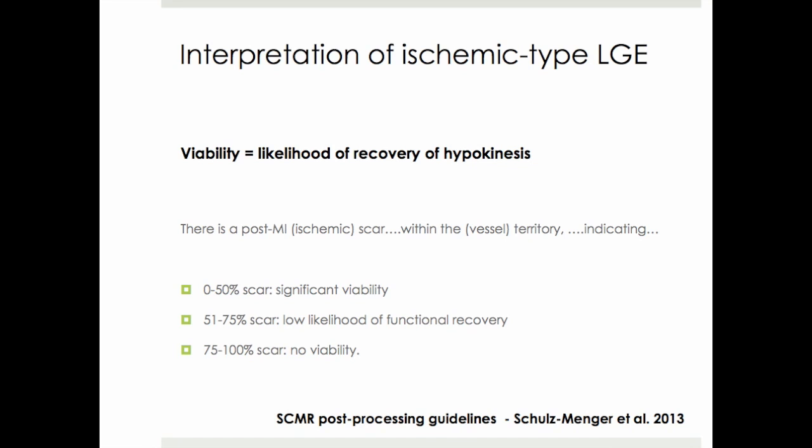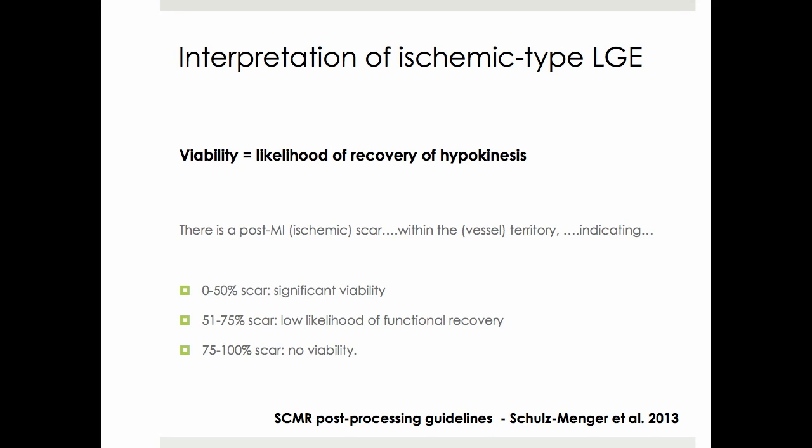This is a quick guide to interpretation of ischemic late gadolinium enhancement for assessment of viability. We declare a postmyocardial infarction or ischemic scar within a particular vessel territory. Based on transmurality of the scar, we indicate the following likelihoods of viability.